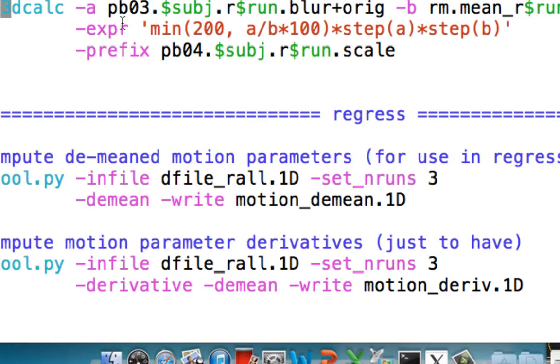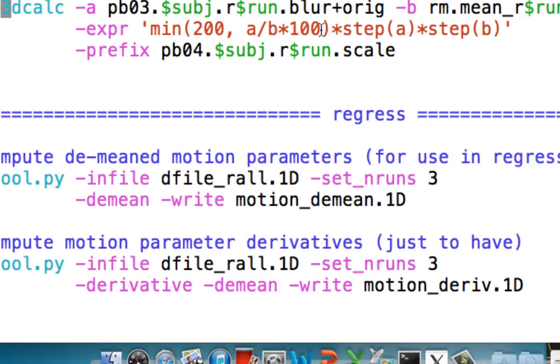And then 3DCalc, what it's going to do here, it assigns a variable to A. That's our blur data set, and B is this mean data set. And this expression here actually does the mathematics, and it's going to scale everything to a mean of 100. So if you get a value of 105, then that's a distance of 5 away from 100, so about a 5% change. And then these are just to make sure that anything that was non-zero in those data sets we entered in will remain non-zero, but anything that was negative will be zeroed out.